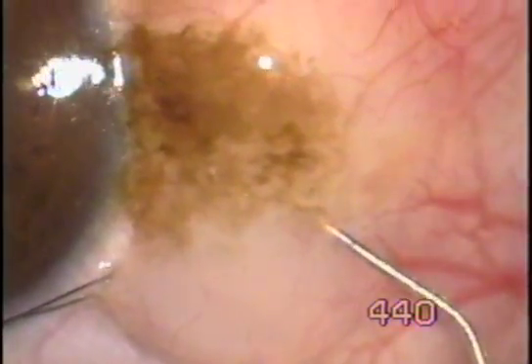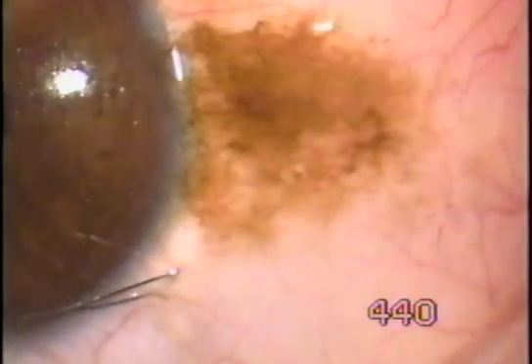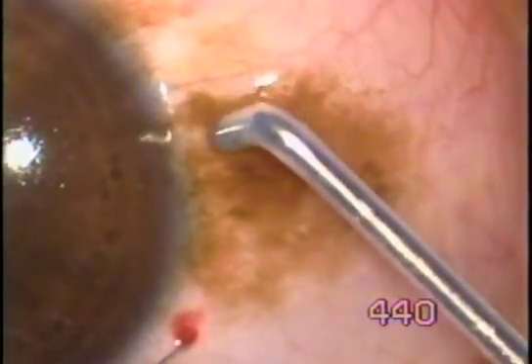The conjunctiva gets ballooned. Then we take a 600 micron fugoblade tip and apply the minimum energy.